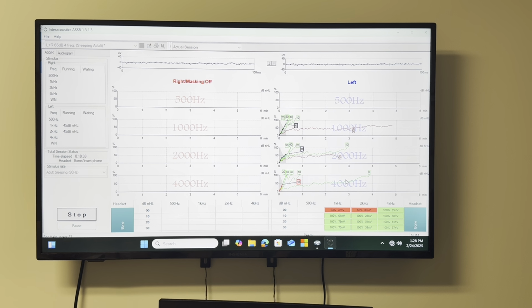Yeah, you can look in the ear canal. What is the dB SPL reaching the ear canal at different intensities? Is it linear, the growth? Test ear, not test ear? It doesn't matter, but yeah, you can do both. You put a probe microphone in the ear canal and see what the level is. That's it.